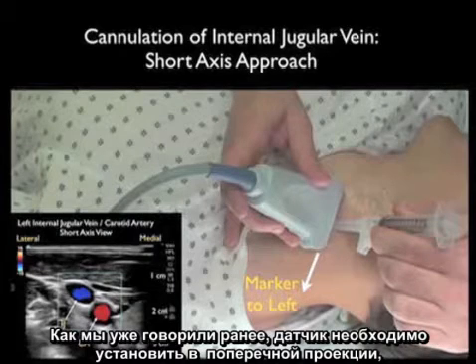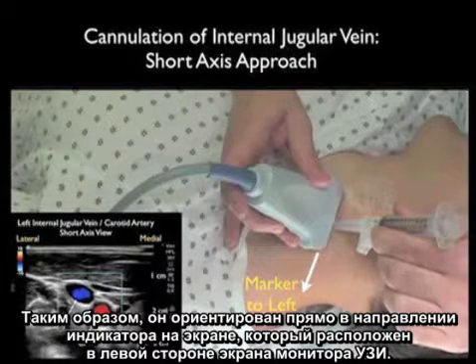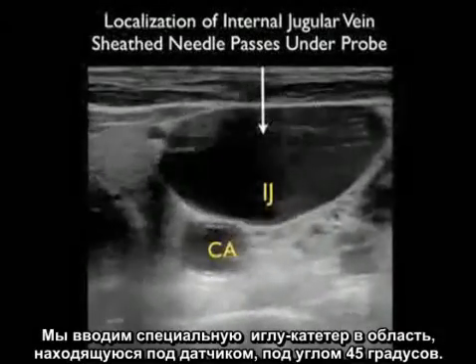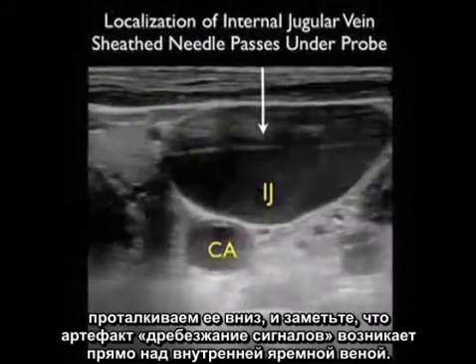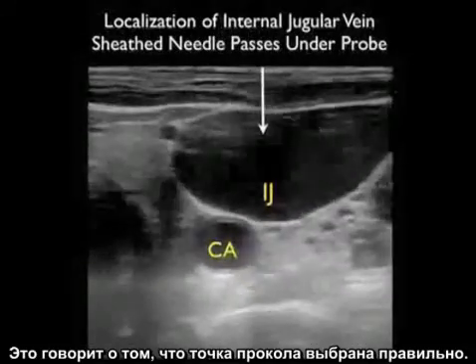As discussed prior, the probe should be oriented in a side-to-side orientation with the marker down towards our left as we stand at the head of the bed, so it orients directly to the screen indicator dot which will be oriented towards the left of the ultrasound screen. Here we're localizing the internal jugular vein using this short axis configuration, coming in underneath the probe with the sheath needle at that 45 degree plane. Notice the ring-down artifact coming in directly on top of that internal jugular vein, telling us this is the correct puncture point.